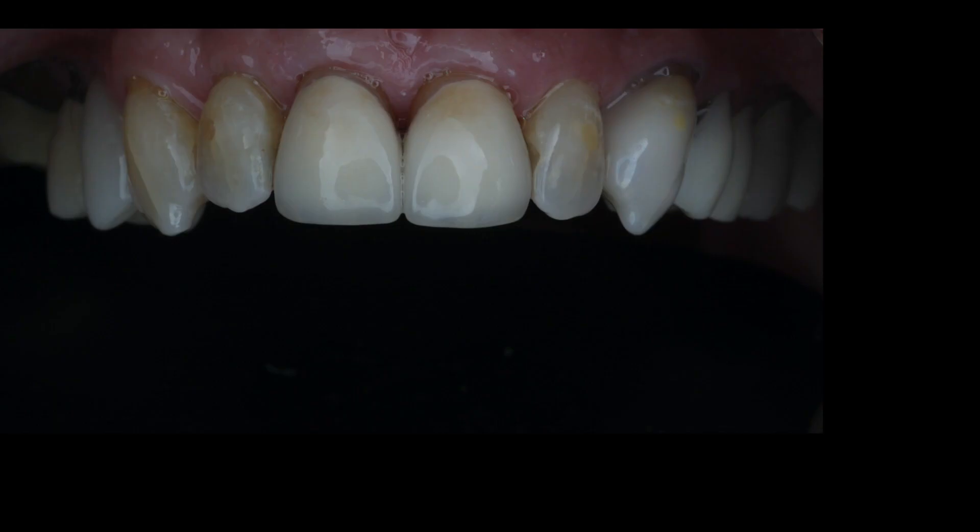So here's the final result. He did want us to match his posterior crowns because I think he said when he's saving up, he wants to do all of his anteriors. Who knows when that will be? This is probably a one-tooth-at-a-time kind of thing, a one-tooth-a-year maybe kind of thing with his finances and things like that. So anyway, I hope you guys learned something, and let's do some more of these. I think it's kind of fun to show real world cases that are not ideal.